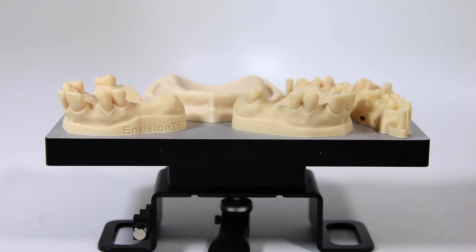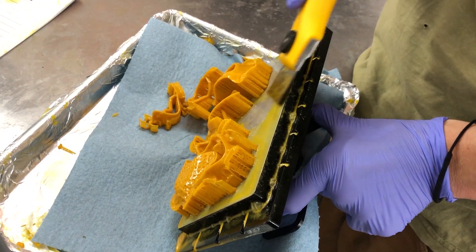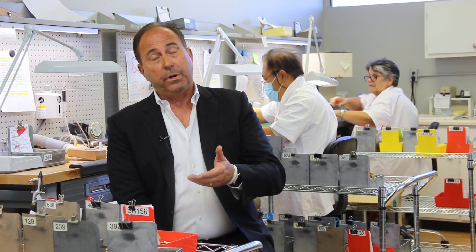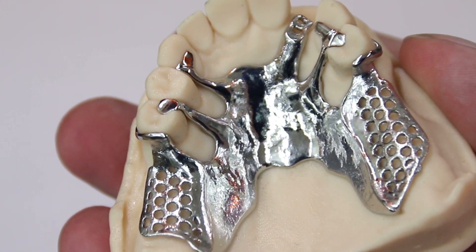We primarily worked with another manufacturer. Their printers didn't keep up with our needs for production and would not allow us to print parts flat. With Envision Tech and the Envision 1 printer, we're able to produce partial denture patterns that are then cast in a little over an hour and a half — a tremendous difference from a year ago when it took us anywhere from 12 to 15 hours to get the same number of partial denture patterns printed.